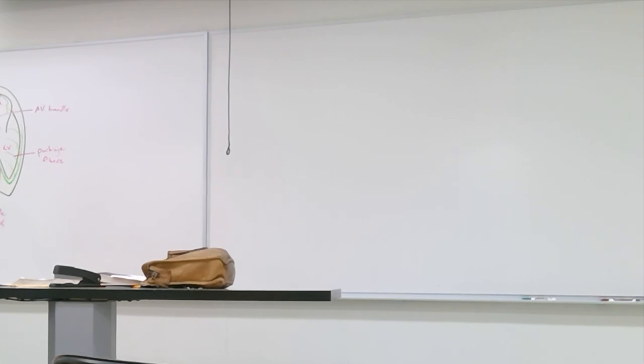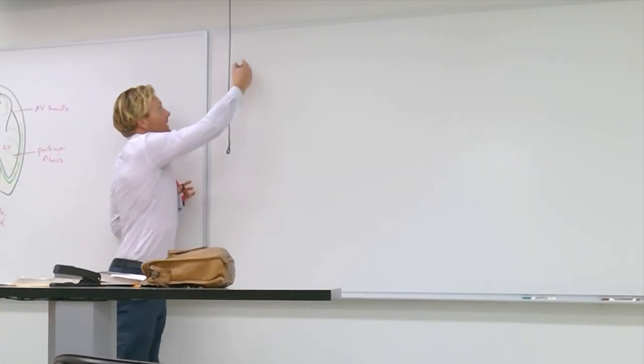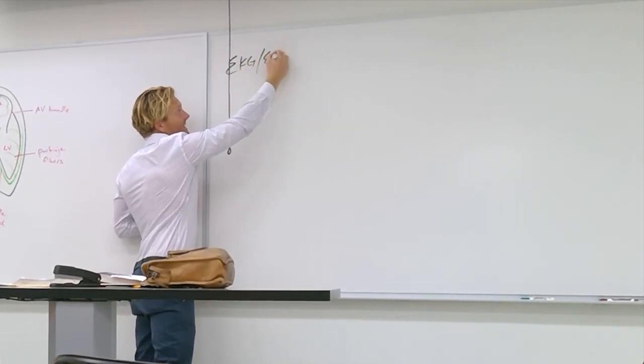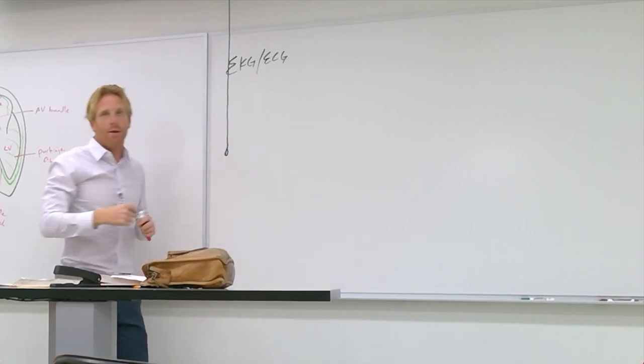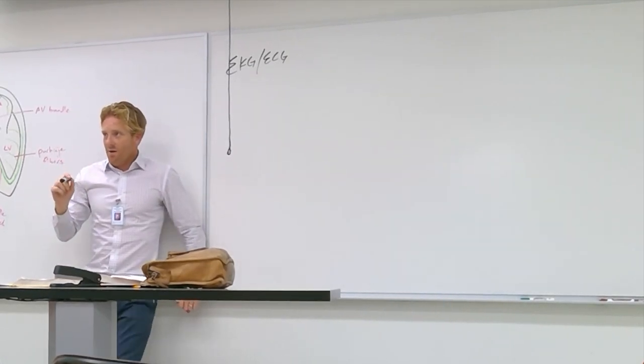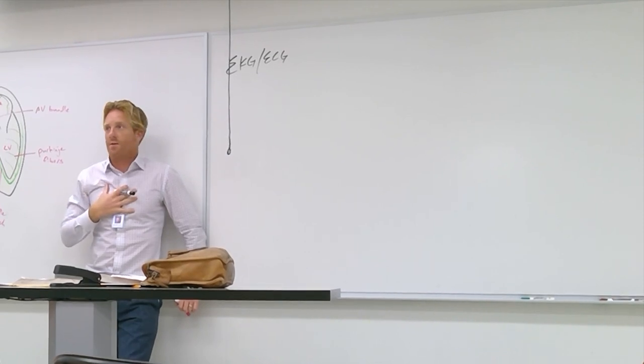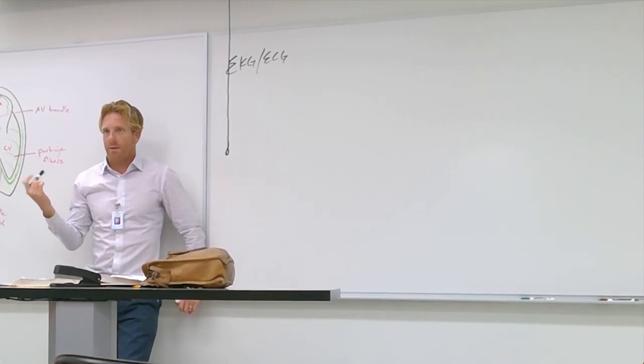So now we need to talk about EKG. An EKG is called an electrocardiogram, and this kind of relates to everything that we talked about. EKG is synonymous with an ECG. They're the same thing. This is a measure of the total electrical activity that's emitted from the heart during a heartbeat or a series of heartbeats.